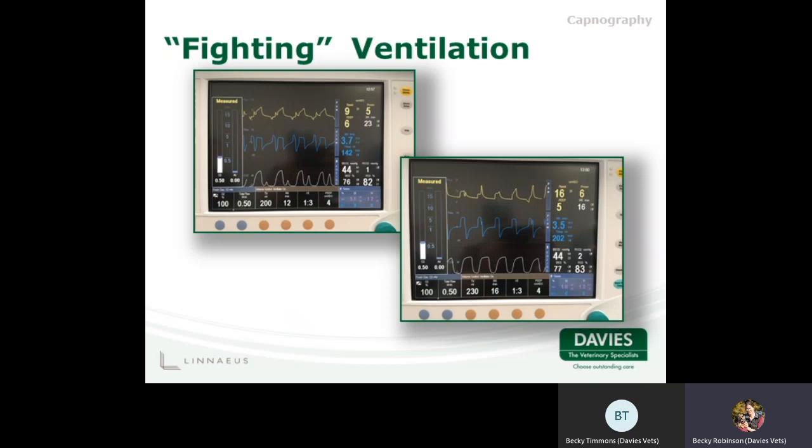Now we can see the ventilator settings at the bottom of the screen in the brown boxes. The number that says 200 is the patient's tidal volume in mils. With a tidal volume of 200 mils, we can assume this patient was about 20 kilos, using the caveat of 10 to 15 mils per kilo for a tidal volume. The next number along is the patient's respiratory rate, set to 12 breaths per minute. This combination of tidal volume and respiratory rate is not adequate for this patient to stop them from fighting the ventilator.